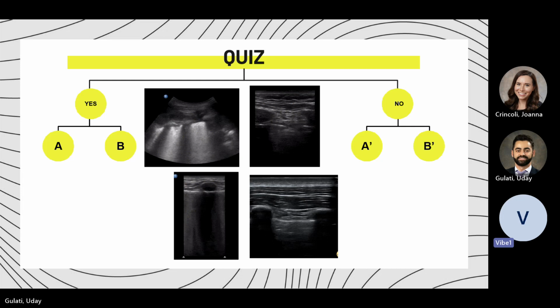So cardiac pulsations are always a normal finding, or not lung pulsations? Yeah, so it's the simple combination. Keep this in mind. This is the simplest way to break it down.